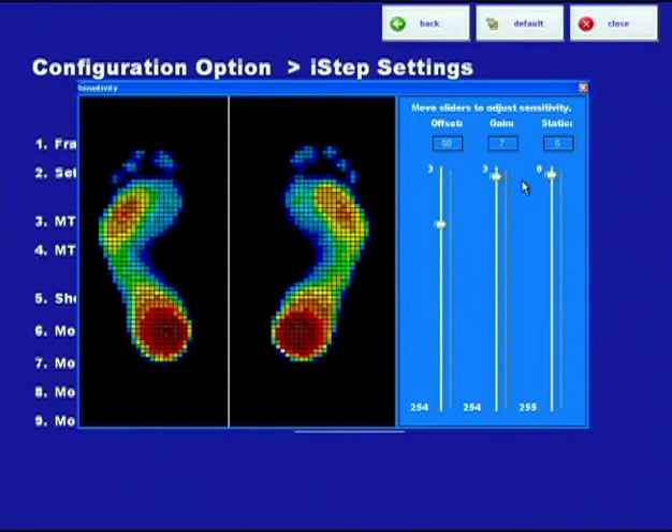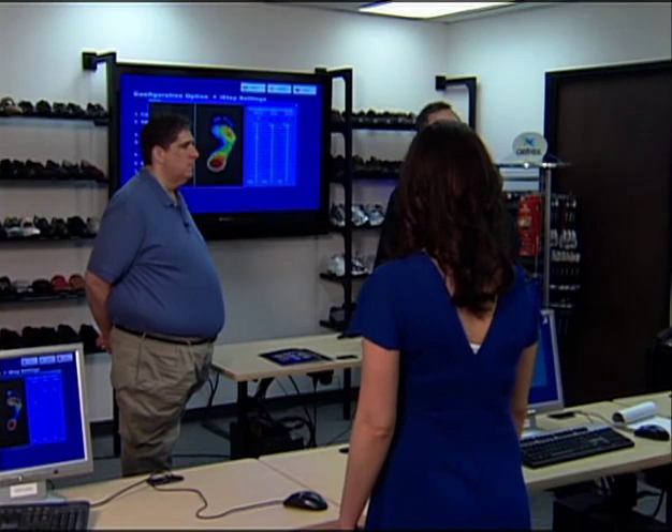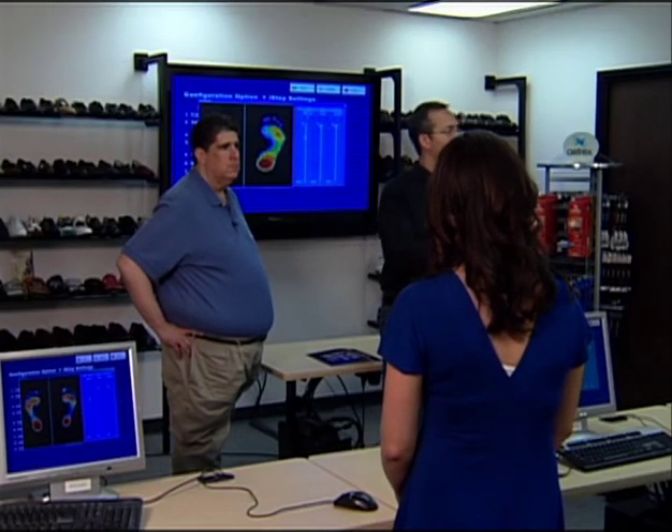This is the sensitivity adjustment portion of the software. It's important to really understand how it works. I encourage everybody to play around with it a little bit, but before you do, remember where it's set. Write down what the three numbers are for your machine so you don't forget where we have it set to. Then play around and see how it changes it, so you can always go back to your default settings. We do set this up for every plate that leaves here. Based on the metal in that conductive mat, there's not a standard that's universal for all machines.